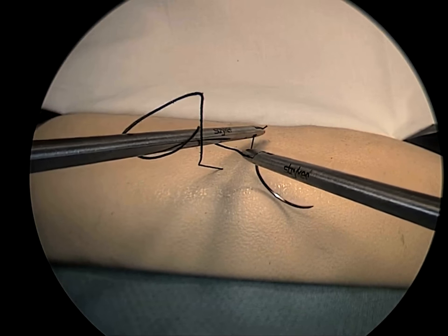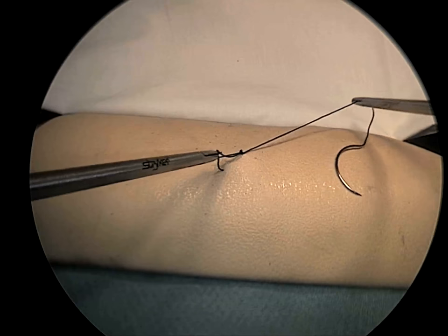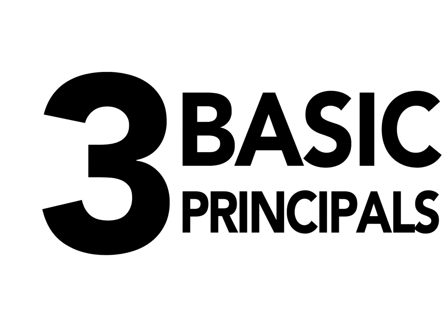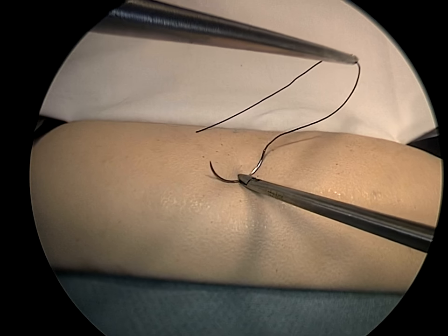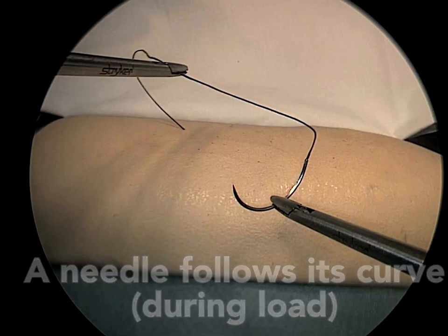Demonstrated clearly is the importance of unloading loops off the instrument and onto the short tag end. We have demonstrated three basic geometric principles fundamental to effective laparoscopic intracorporeal suturing and knot tying. A self-righting load of a needle depends on creating a soft tissue curve.